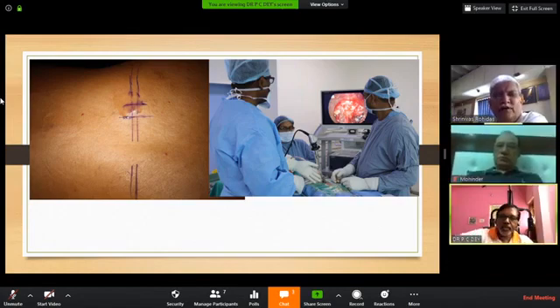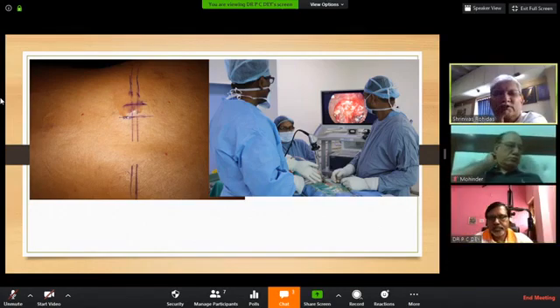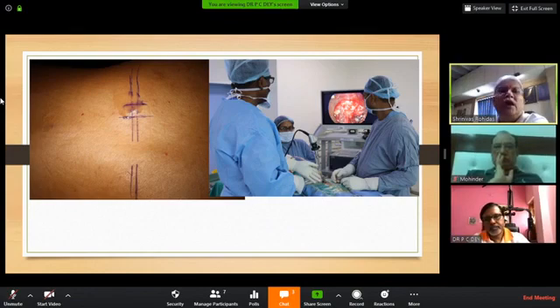The anatomical orientation of the first view after putting the outer tube should match the interlaminar window you see in the AP X-ray of the lumbar spine. If it is not matching, it's a wrong level. Check it again. In the initial stages, check the level with the outer tube in place, take the C-arm, recheck it, and then start.